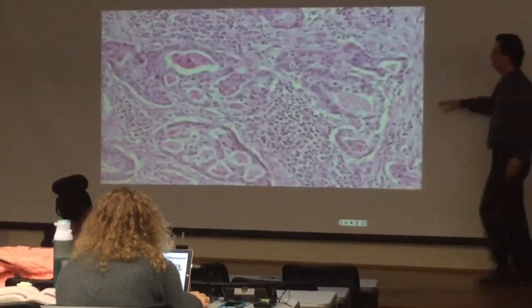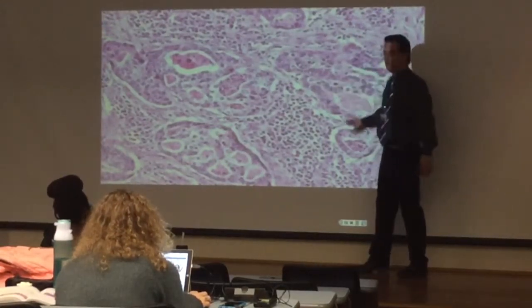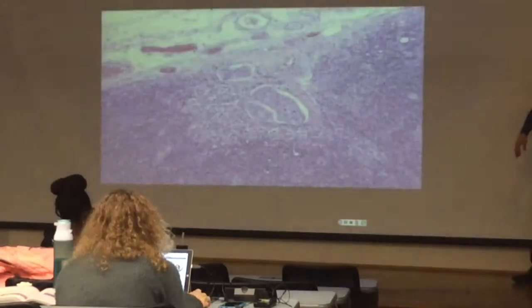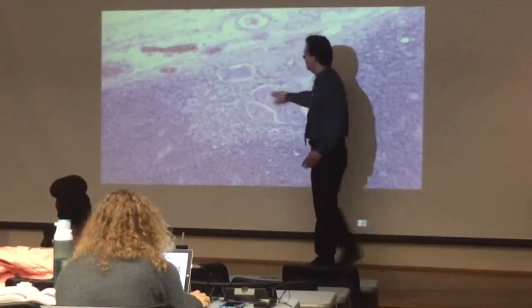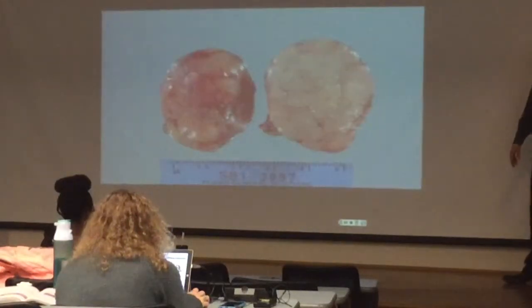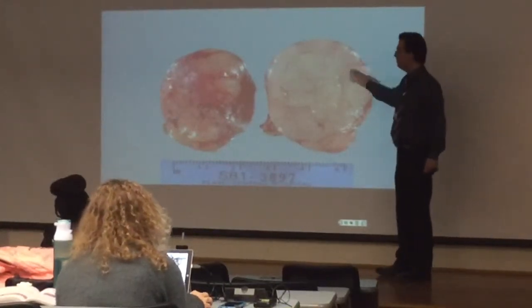And this is another picture. You see this is our invasive ductal carcinoma, so it is still making ductal structures. So that's important. Now, these are in the sentinel lymph node in our case, so you can appreciate these are all invasive ductal carcinoma metastasized to the sentinel lymph node.